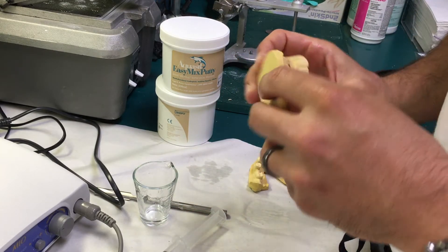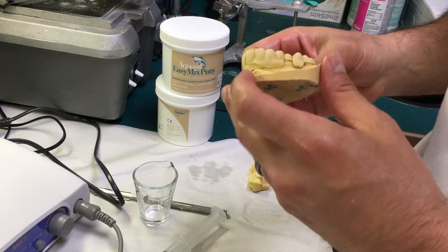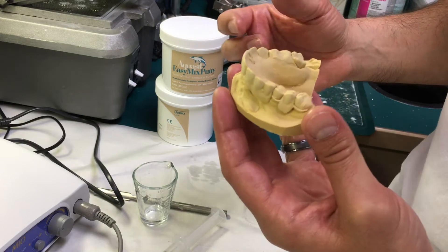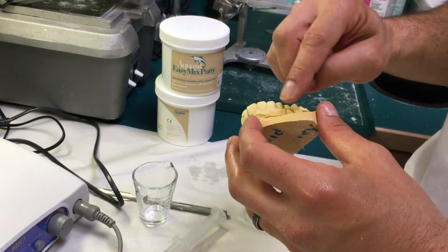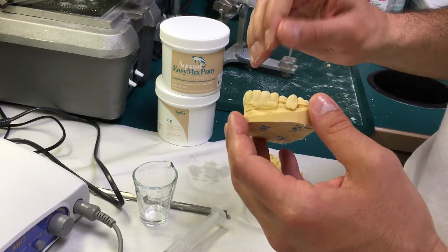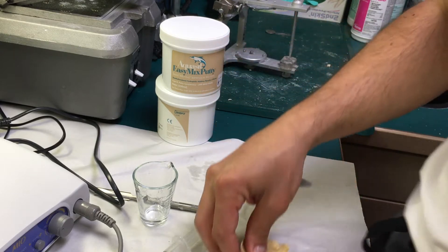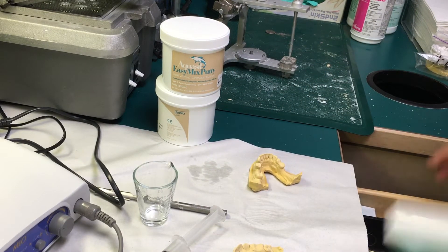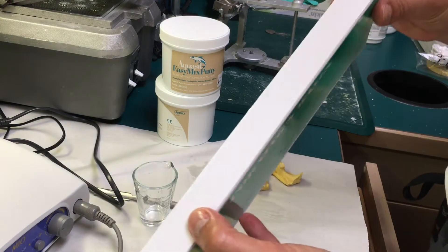There are some undercuts here which I really don't care as much about having that amount of detail when I'm making the radiographic guide. Some of these I will most likely block by using some rope wax — it's pretty easy, pretty cheap to find, and it comes in a package like this.